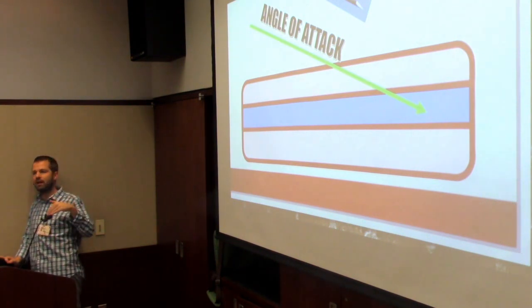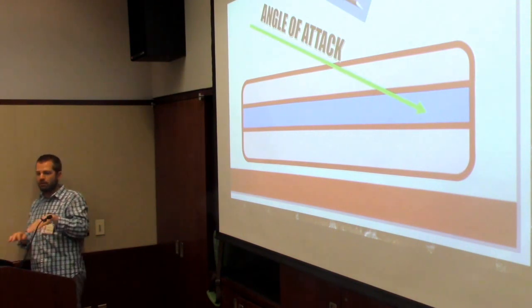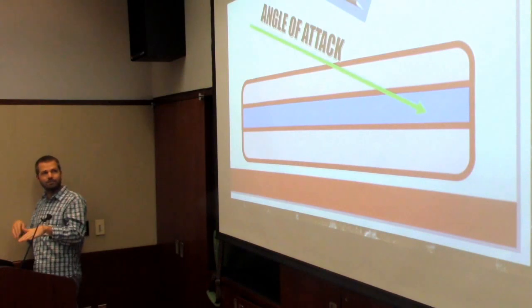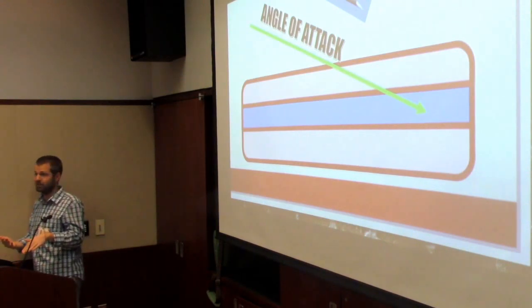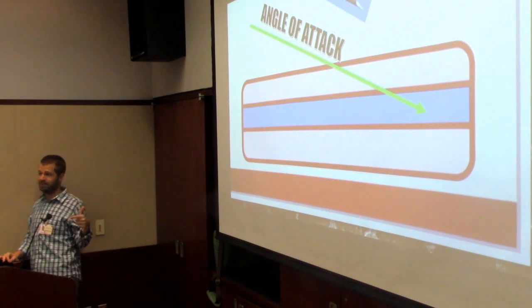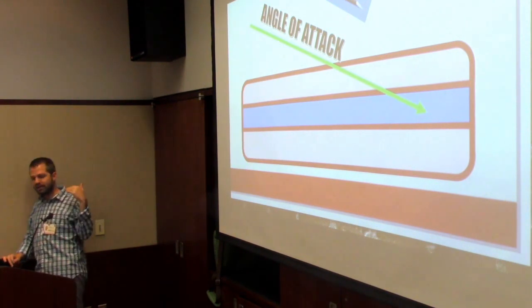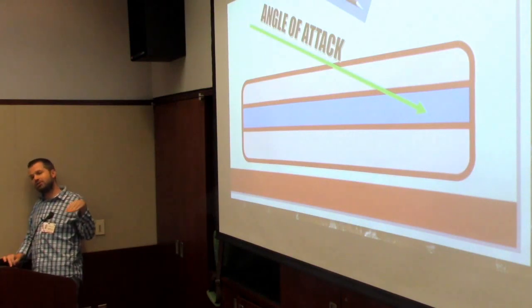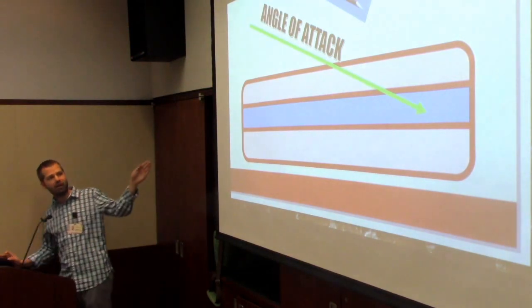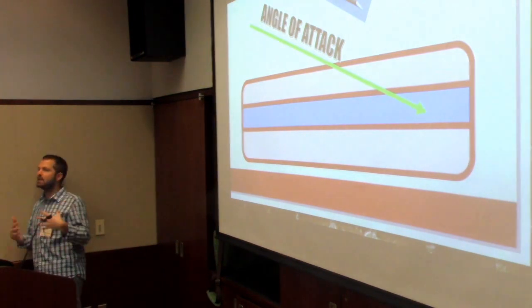So having the bevel up, you're still making a cut, you're just making it on a slightly different plane, but then you have all that resistance behind it. Probably isn't good for the vessel you're stabbing into, because your goal is to get into that tube without shredding it to pieces. Going through and through a bunch of times, you're probably shredding that vessel to pieces. It's not going to last long. And if you're going at such a low angle of attack, trying to be super graceful about it, you're probably just scratching off the entire top portion of that vessel. So just think about the angle of attack.